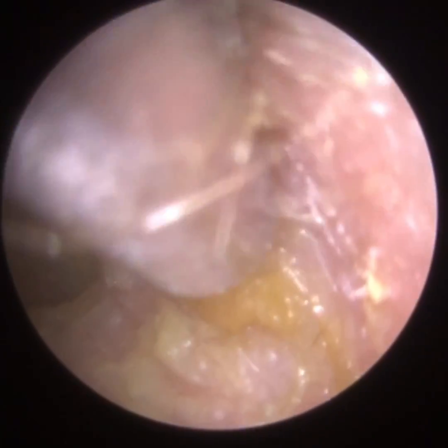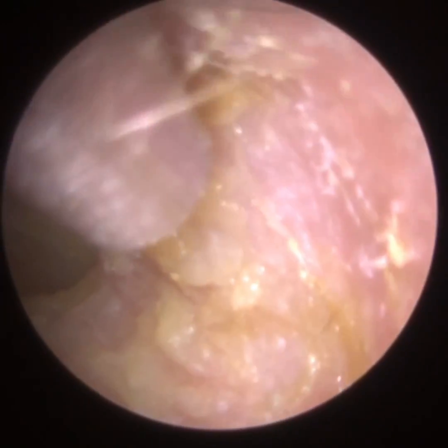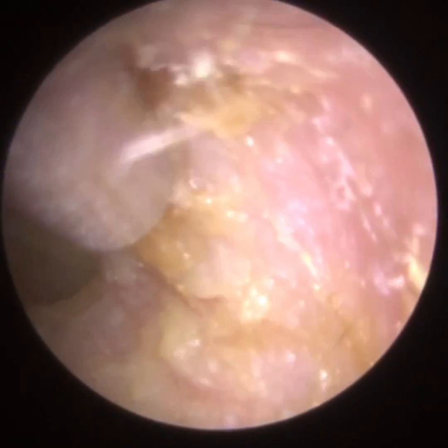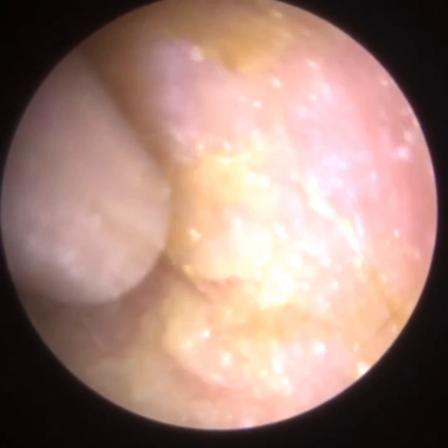So you need a very steady hand when we do this. And at the moment, I'm just using a standard Zollner suction probe. Now we're approaching the bony part of the ear canal, so here I'm just being extremely cautious. And it's a very tedious procedure. Now, when we remove the dead skin, discharge, it does give some patients some short-term relief.